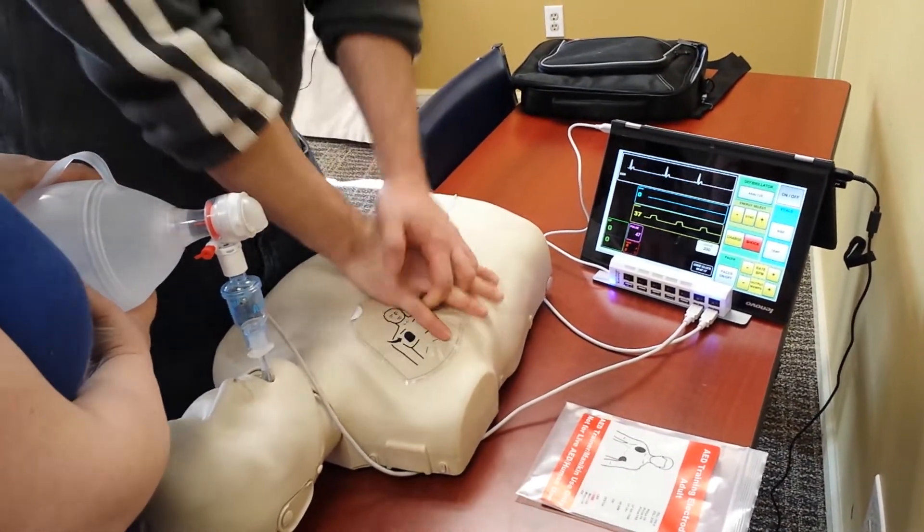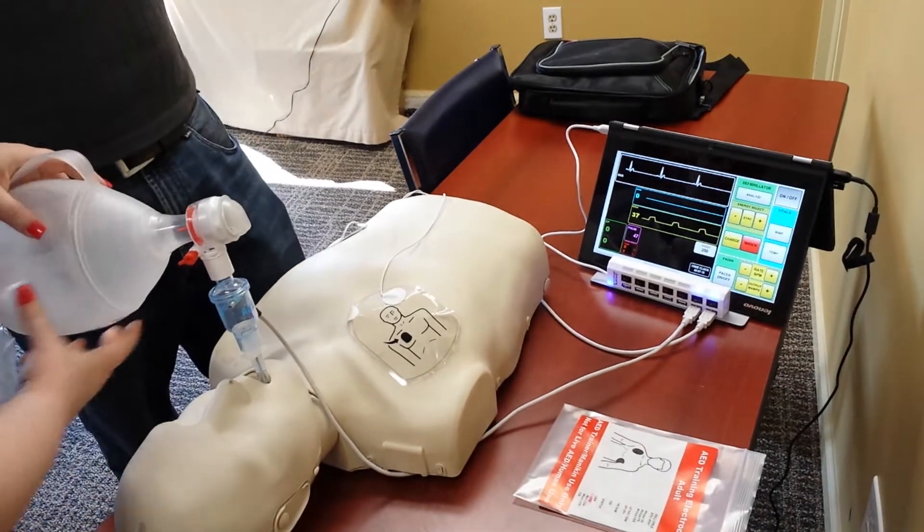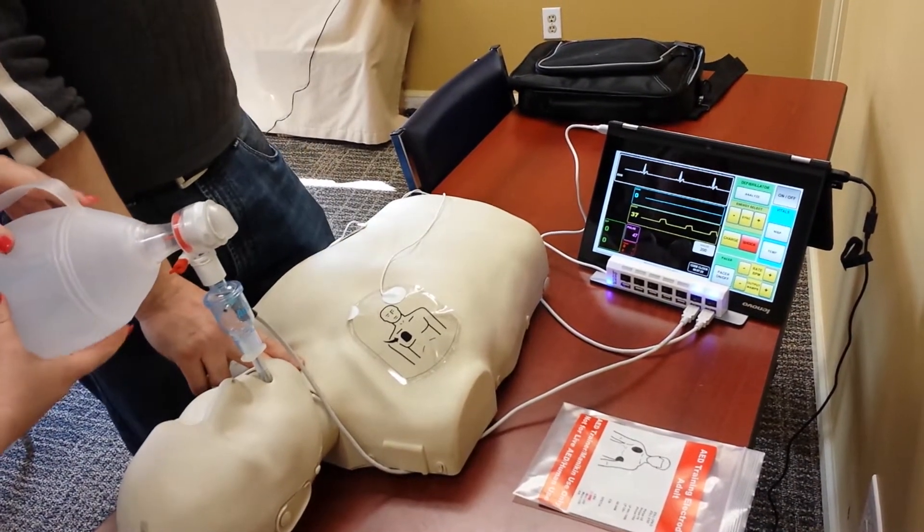CO2 is kind of high. Let's stop CPR. Alright, that looks pretty good. Let's check a pulse.